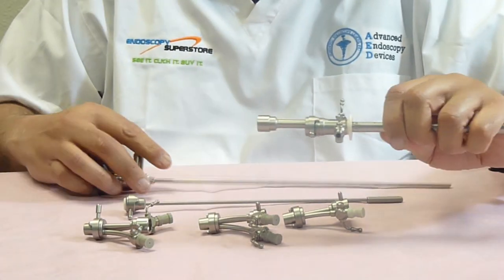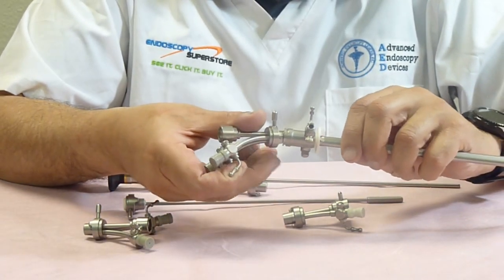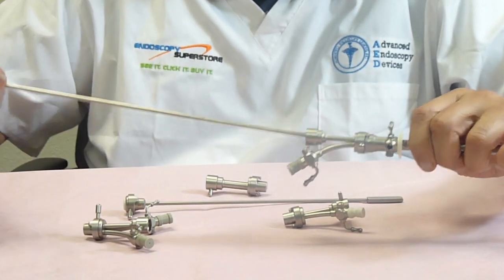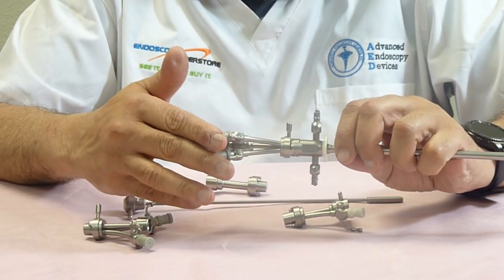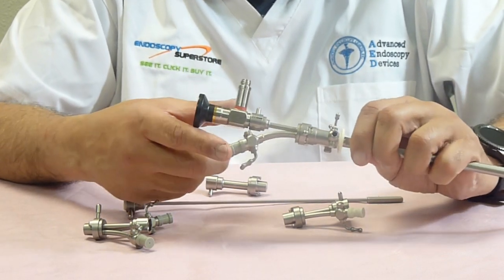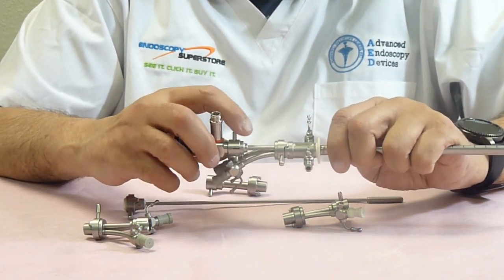Now if a doctor wants to use a double channel bridge and wants to pass other instruments down, he's easily able to do that. Pass the scope in, and now it's very simple — you have two channels. You can pass two different instruments in. You may want to take a biopsy on one channel, and you may want to do a Bugbee on the other if you have a small bleeder. So that's available.